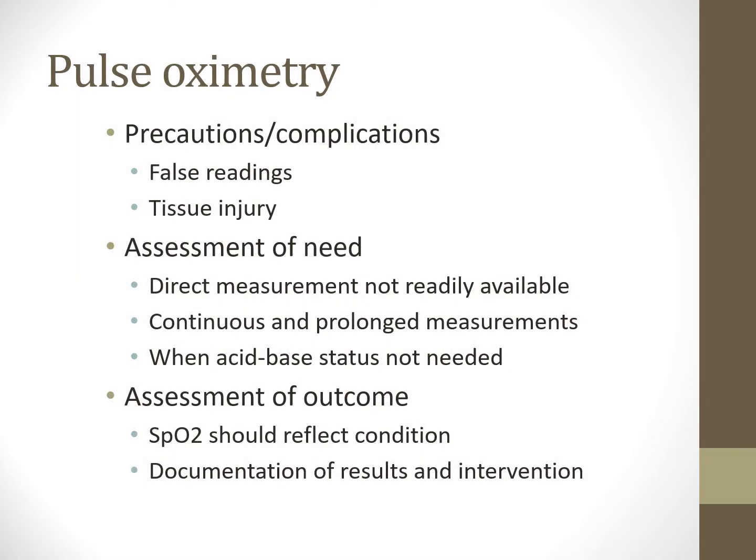Precautions, false readings, that's one of the biggest things to look out for. I've seen pulse oxes disconnected from the patient, and they're on the bed rail of the bed, and they're reading a reading. Or they're in the sheets of the bed, and it's reading a reading. It has a reading. So be cognizant. It is a machine, just like any other machine. It has little idiosyncrasies, so you just got to understand that.